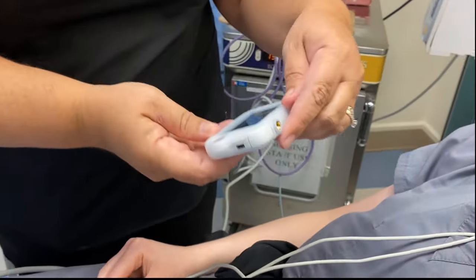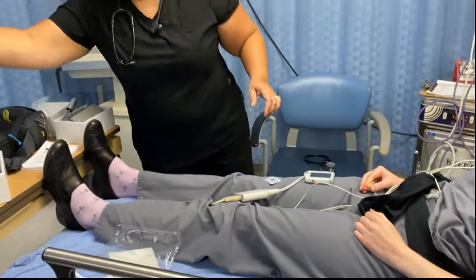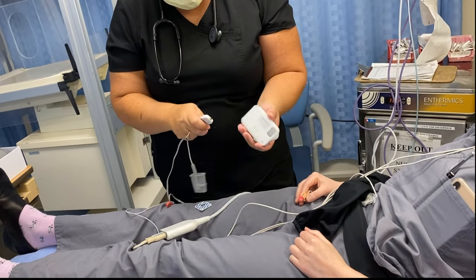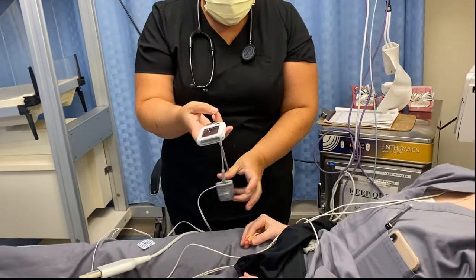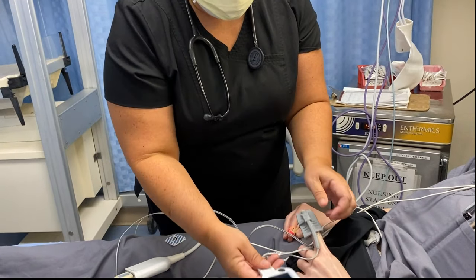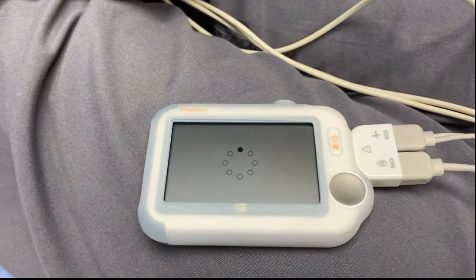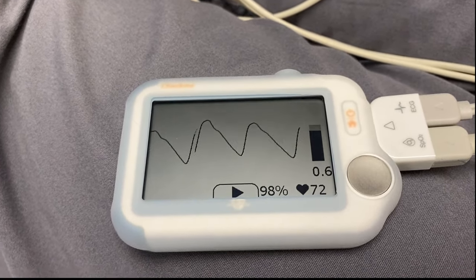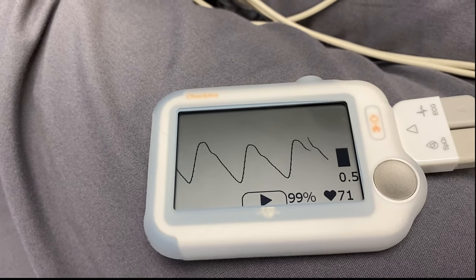The perfusion index is 0.7. The other way to do pulse ox is with the lead — it plugs into the side, and you simply have the patient put their finger in. There's a fingernail indicator showing which way your finger goes. Push the sat monitor again. Good waveform — she's 99 on the machine and 99 on the other, with 98 on one reading. Perfusion index is 0.5, heart rate 71. It's a continuous running measurement.